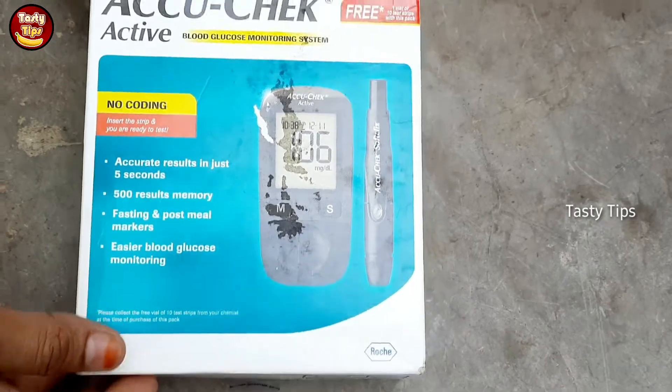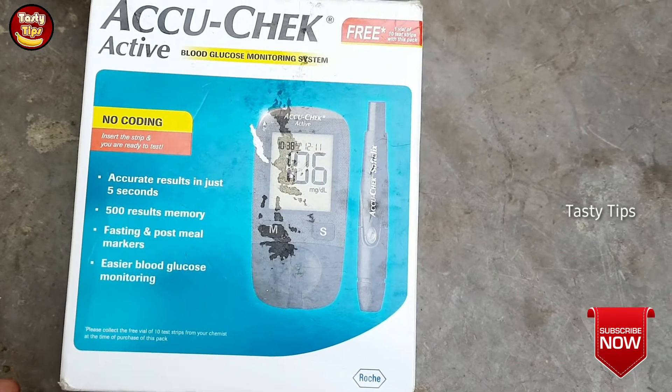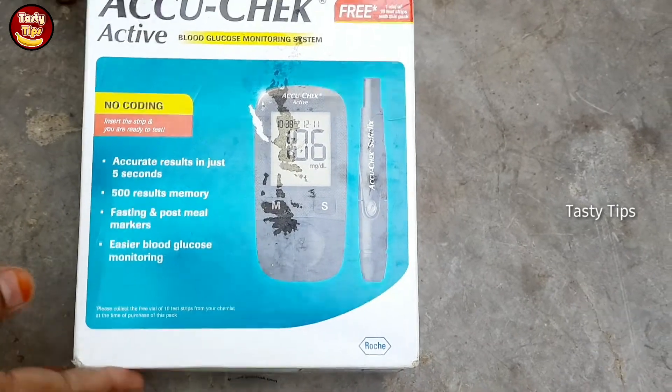Hi friends, I am going to show you a very useful video. I am going to check the sugar in the lab. I am going to check all these products online.